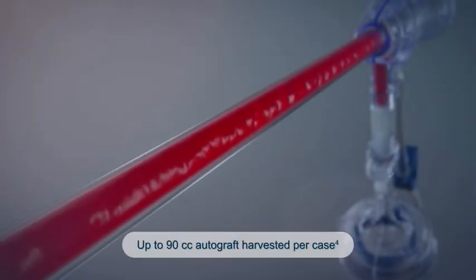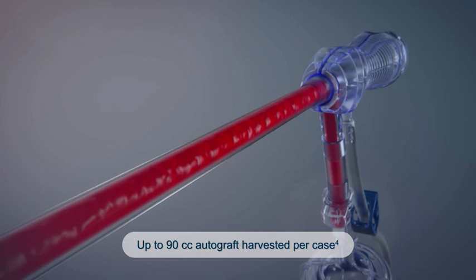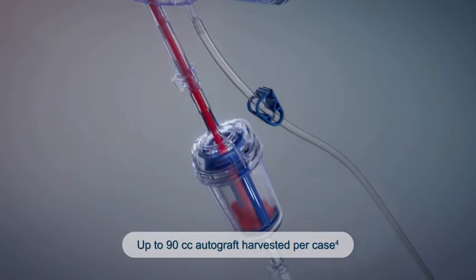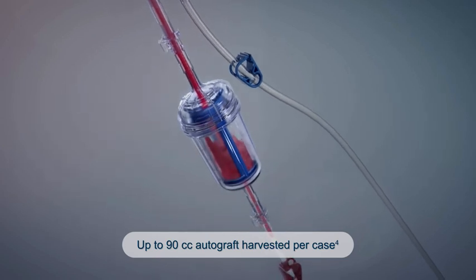The RIA2 system allows more graft to be harvested — up to 90 cc — has reduced donor site pain scores, and has a lower rate of complications compared to iliac crest harvesting.